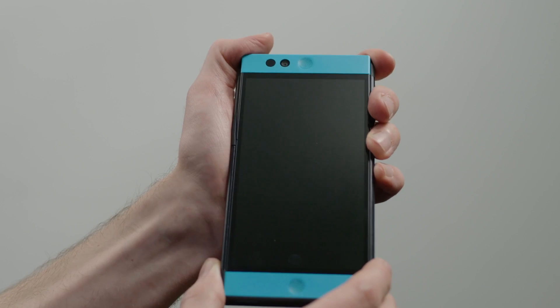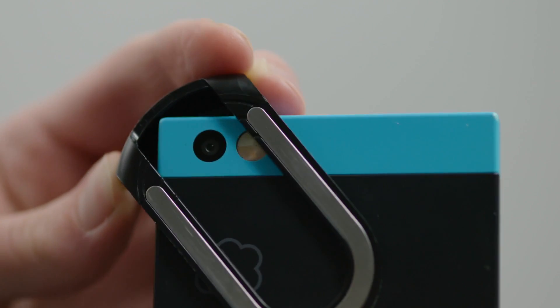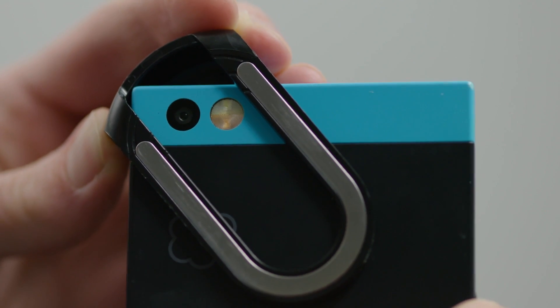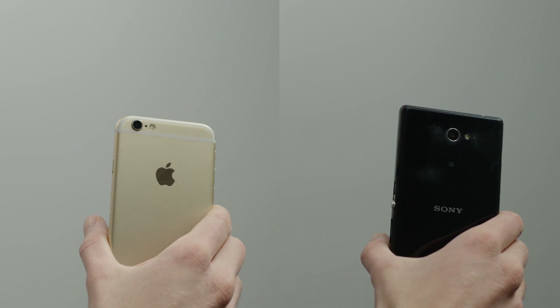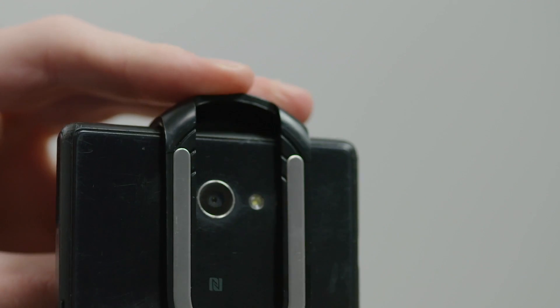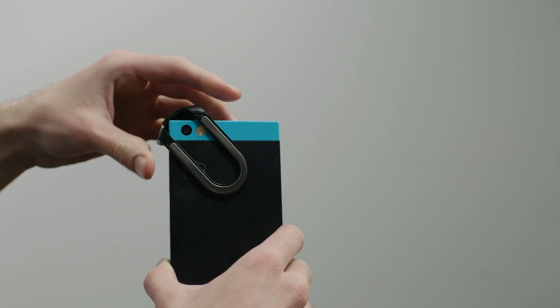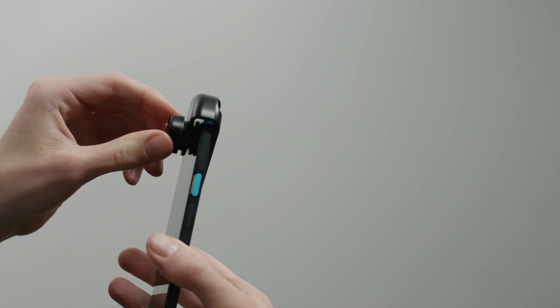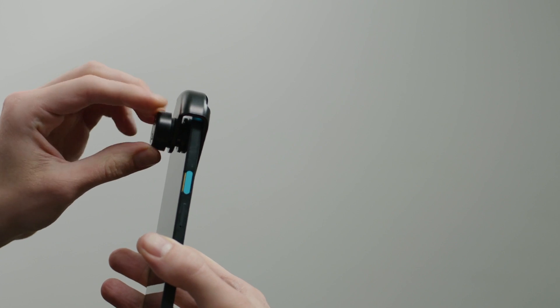If your phone has a cover, remove it. Slide the clip fully over your smartphone and adjust the position so that your camera is midway between the sides of the magnetic strip. The clip will fit a variety of smartphones. Depending on where your camera is located, you may need to slide the clip over the side, centre, or corner of the smartphone. Once the clip is aligned, gently tighten the dial by turning clockwise to hold the clip in place.